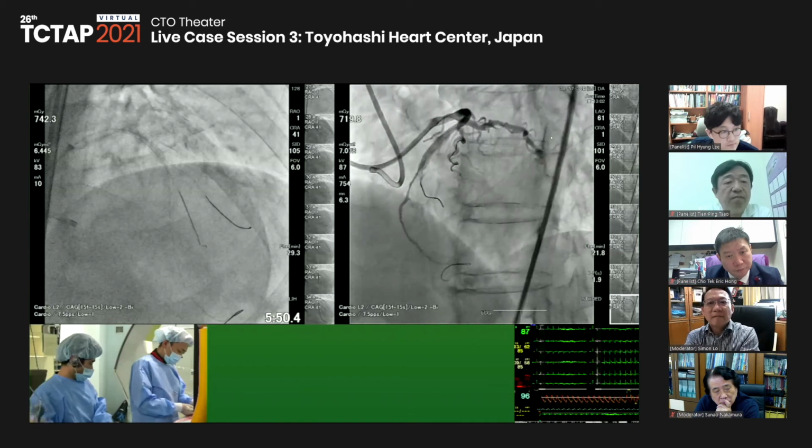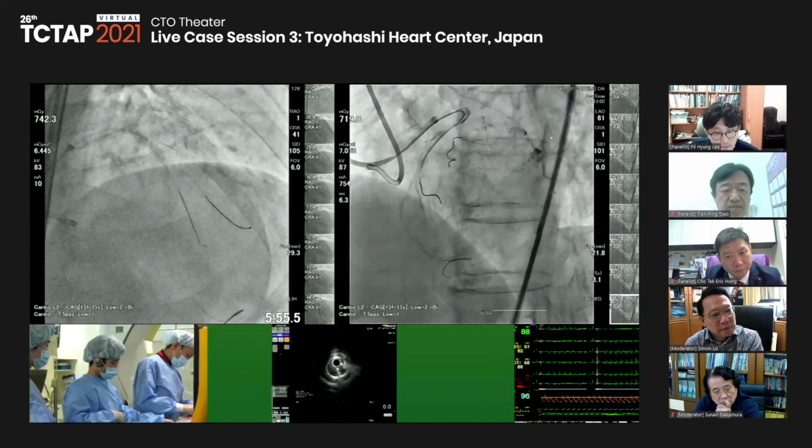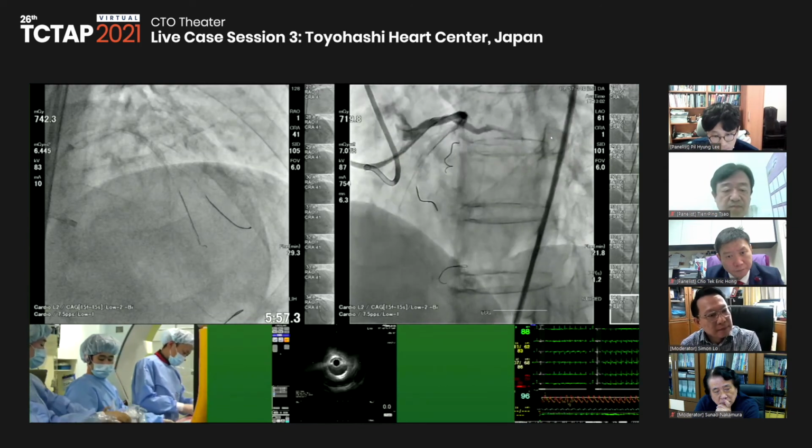So I want to confirm the wire position and then decide the balloon size for the final kissing inflation.